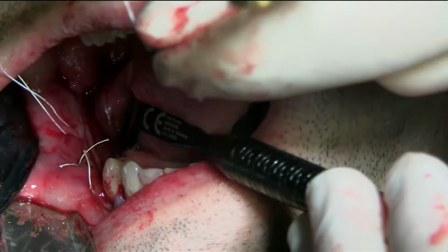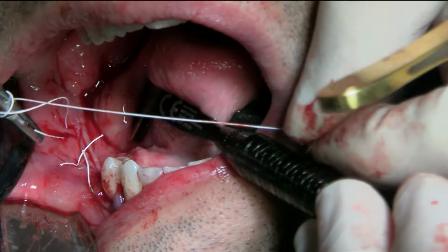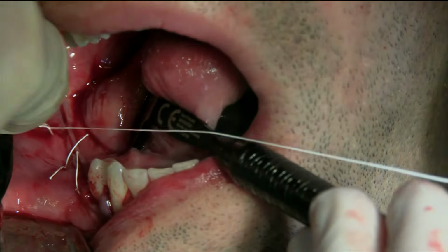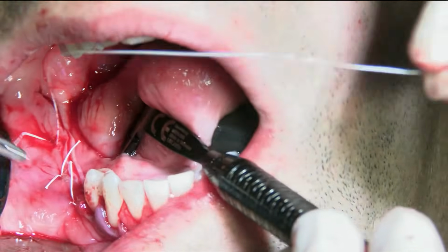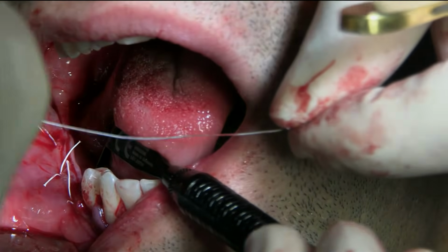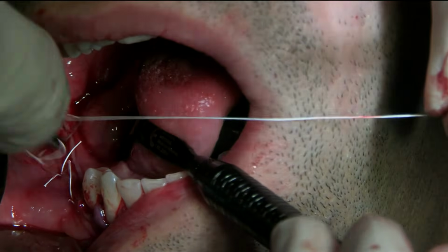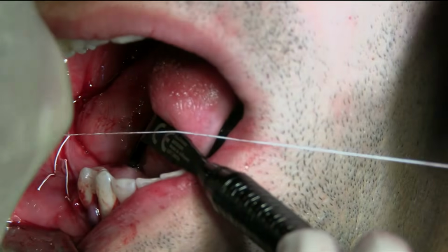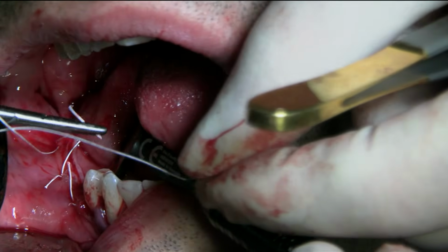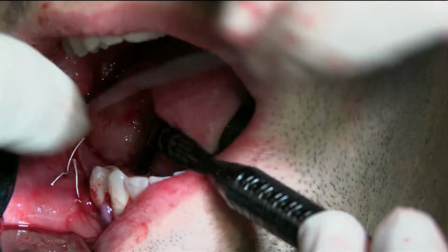The doctor wanted to come here for 2 minutes. Is it okay? No, he came in for a little bit. Or she? Oh, she? Yeah, that's okay. If she wants, it's okay. There we go. Another pop there.